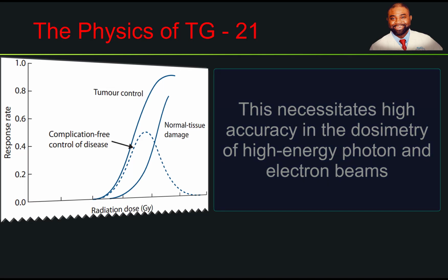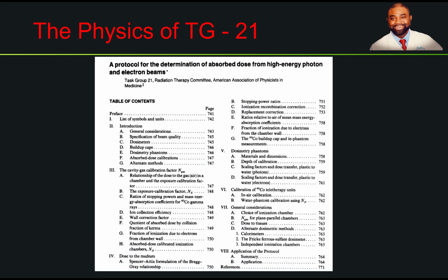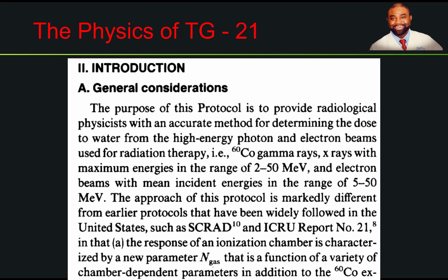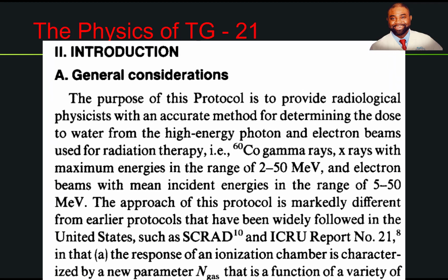This brings us to the crux of the matter, TG21. TG21 is actually one of the foundational dosimetry protocols designed to provide qualified medical physicists with an accurate method for determining the absorbed dose to water for a medical linear accelerator.